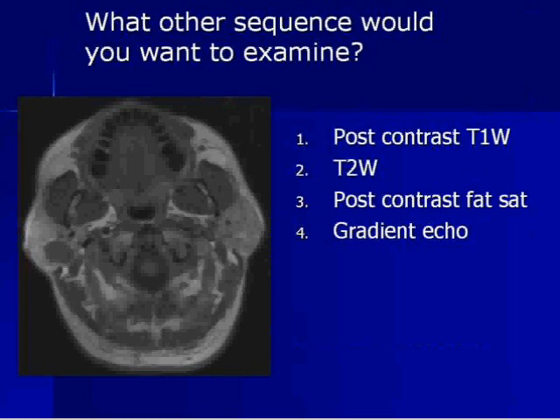Is it 1, post-contrast T1; 2, T2-weighted image; 3, post-contrast FAT-SAT T1; or 4, gradient echo? The answer is a T2-weighted sequence.